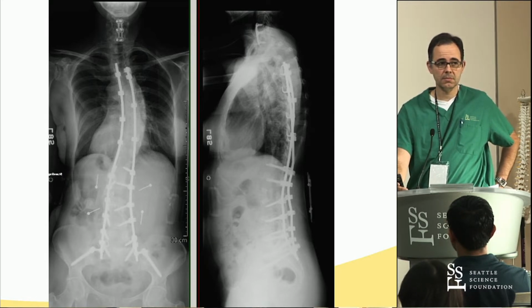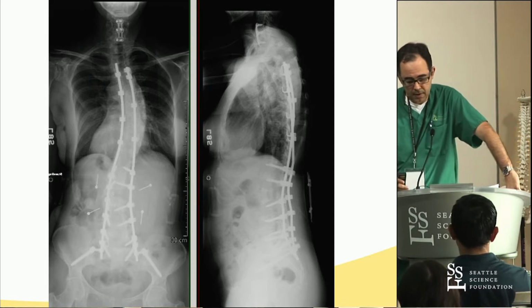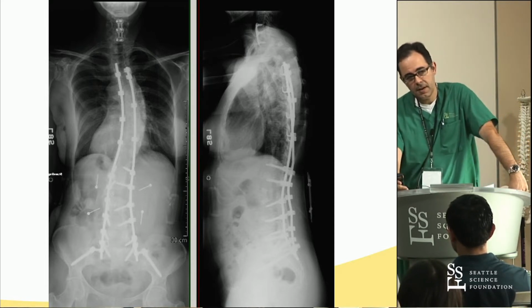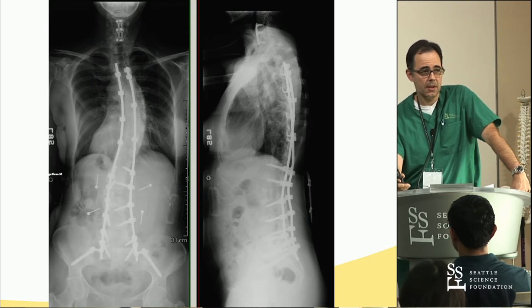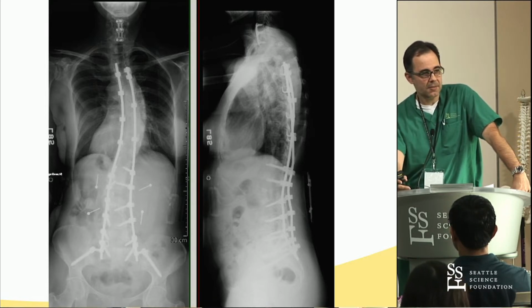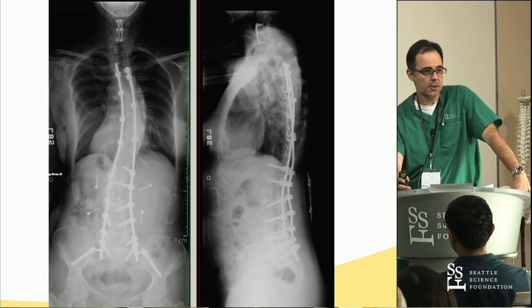25% pain, is that with standard iliac or S2AI? Is there a difference? I'd say probably the vast majority of all of the pelvic fixations that I do are just standard iliac screws. Only recently, within the last year, have I been doing S2AI screws. So I have the feeling that the patients in whom I've done the S2AI screws are no different than the iliac screws. So, but we'll see.